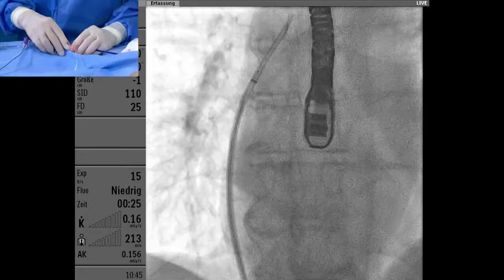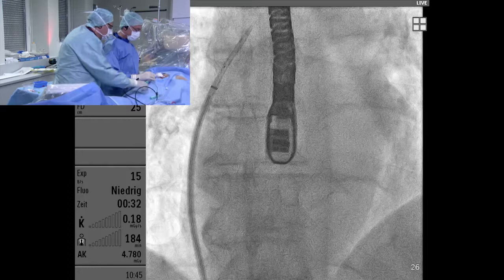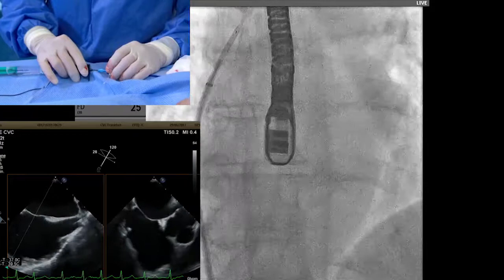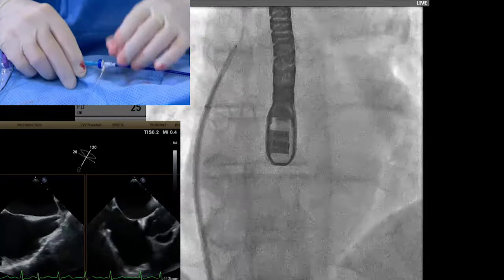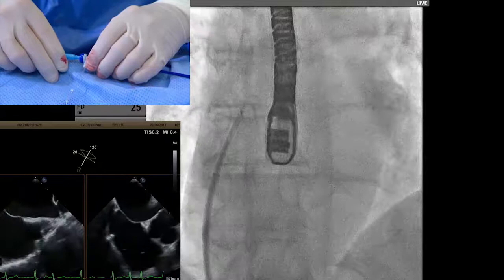You can see the tip of the sheath and the marker at the tip of the needle. The needle is oriented towards about 5 o'clock. I go in up to the tip of the dilator and pull back. For LAA closure, we want to puncture inferiorly and posteriorly.